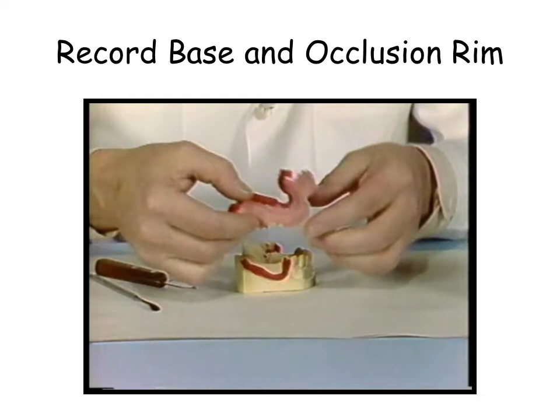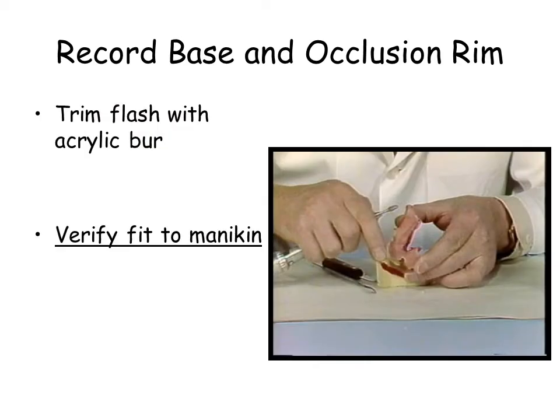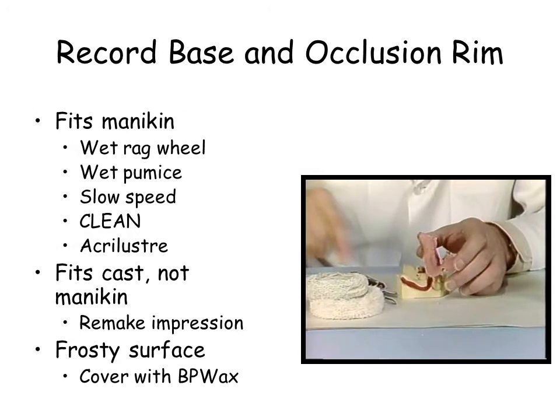Verify that the record base fits the simulated patient before proceeding. If the record base will not fit the simulated patient, the diagnostic cast is faulty and should be remade. A frosty surface may be covered with pink base plate wax. If it fits the simulation, proceed to smoothen the record base using wet pumice.